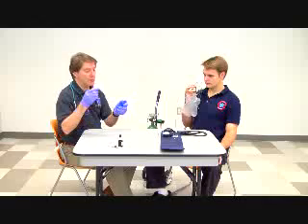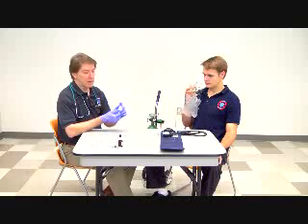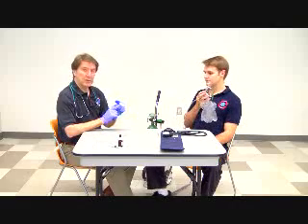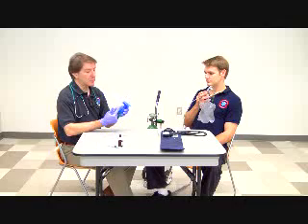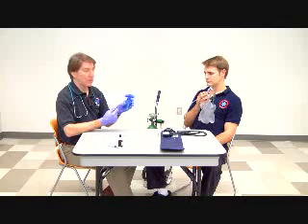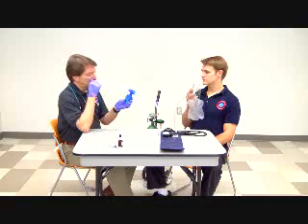We're going to put that on, and we're going to apply the mouthpiece to the opposite side. Lots of patients don't like the idea of your handling the mouthpiece, even if you have gloves on, so it's a good idea to keep the mouthpiece in the plastic packaging until the very last moment. All right, I've checked my med, I've checked my equipment, I've assembled everything.